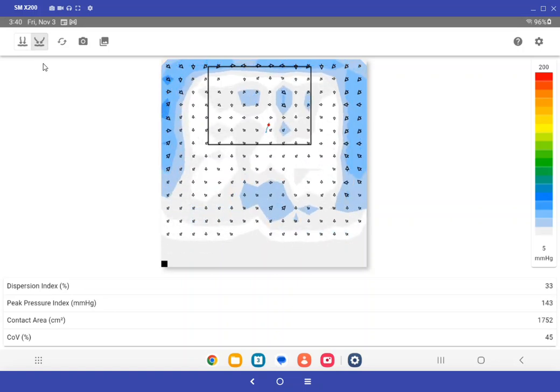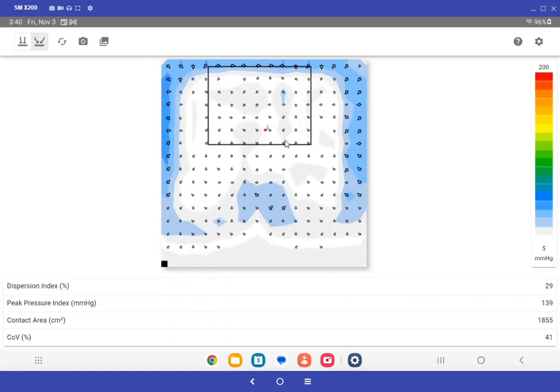So gradient, wherever you see hotter colors and larger arrows, that's an indication of where the pressure is changing over the surface of the seat faster. So we're measuring millimeters of mercury per centimeter here, movement horizontally across the seat. Some people like this information. It just gives a quick view of where shear might be happening in the surface.